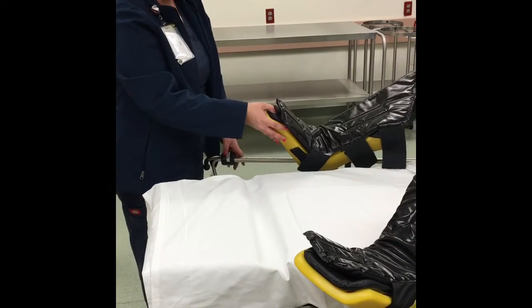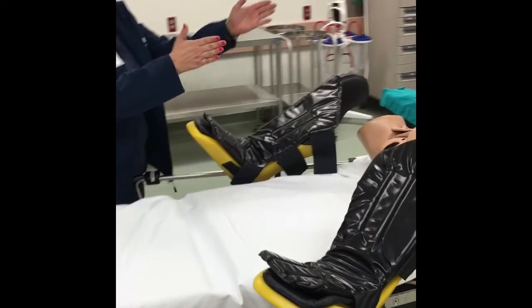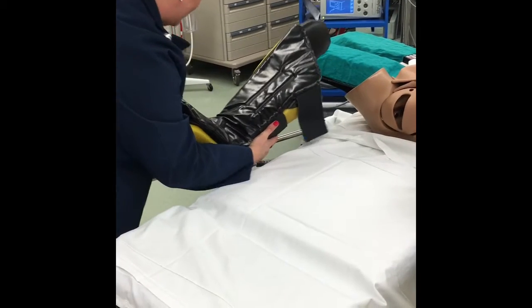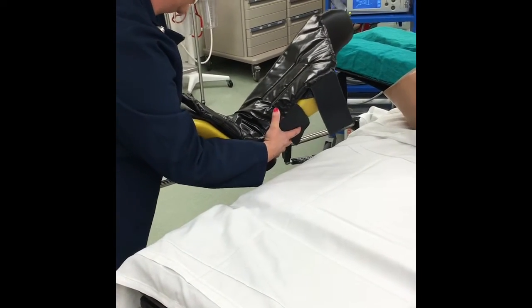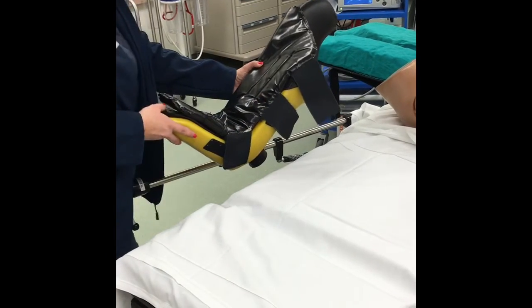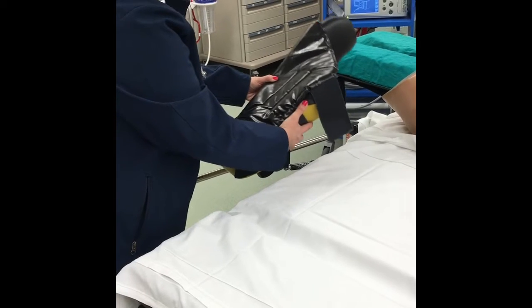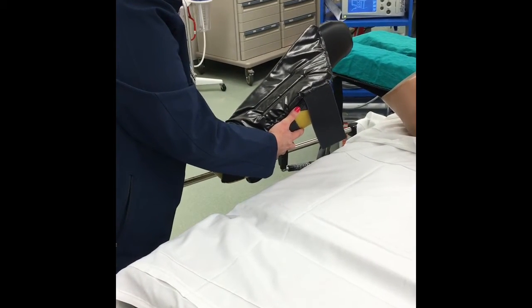So for instance, this stirrup looks a little bit too far this way to me, so I'm gonna turn it to where it's facing the shoulder. So now it's facing the shoulder. And if you notice, when you have their leg in, to have good control, you can put this against your belly and hold it here to move it up or down. And then it just locks into place.